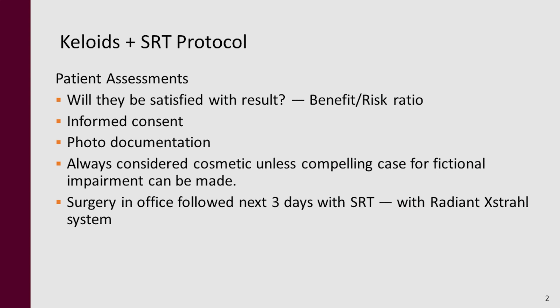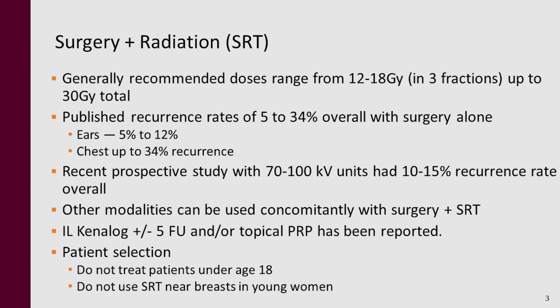So basically, the protocol is that we do the surgery in my office, and then the same day, for 3 days in a row, we treat it with SRT. If you look at the literature, all of us have to derive our own protocols based on what other people do. There's no FDA-approved absolute protocol.